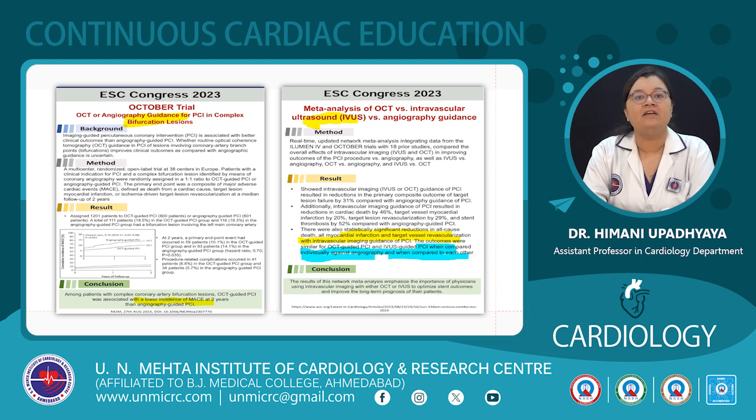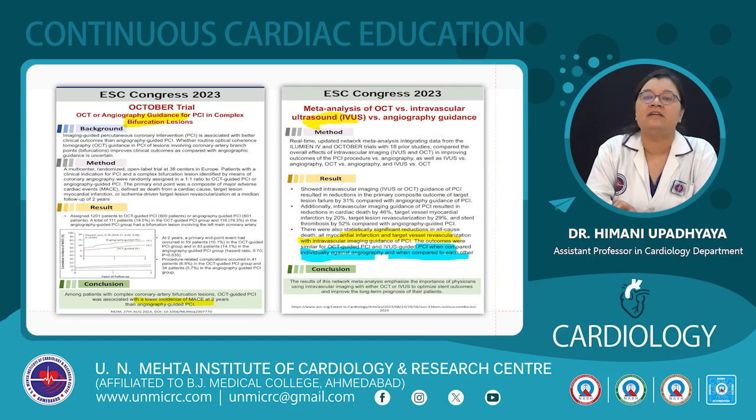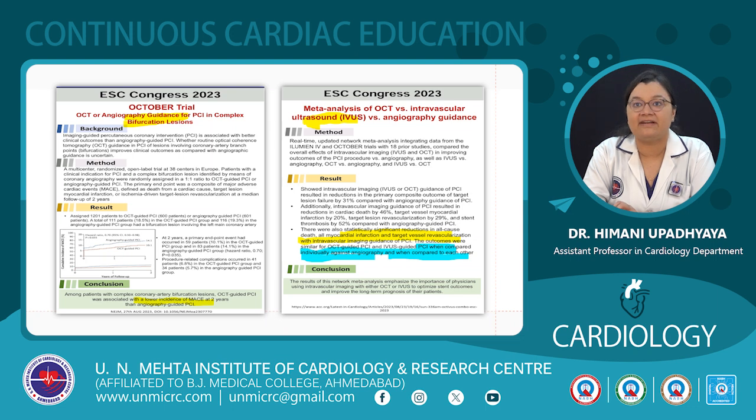In the OCTOBER trial, among patients with complex coronary artery bifurcation lesions, OCT-guided PCI was associated with a lower incidence of MACE at 2 years, and there was a meta-analysis of OCT versus IVUS versus angiography-guided PCI, and intravascular imaging-guided PCI showed a statistically significant reduction in all-cause death, MI and target vessel revascularization rates. Hence, it provides good long-term results.